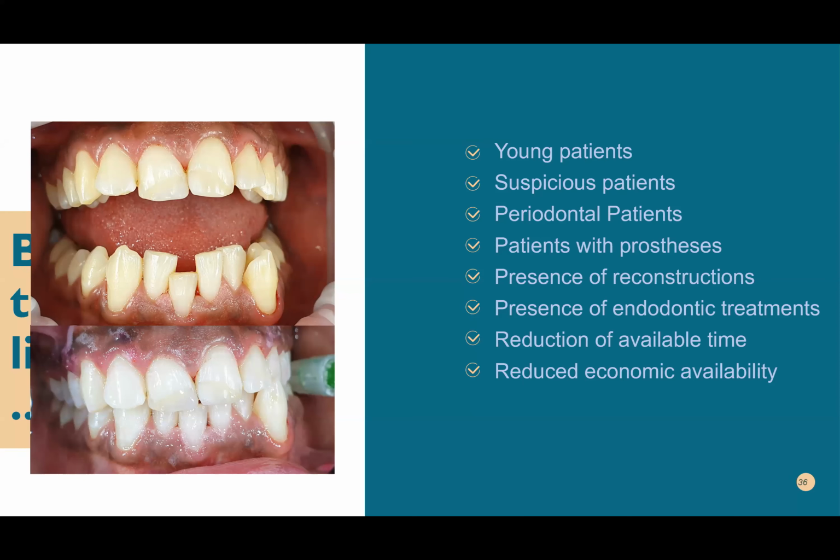This was at the beginning in the top image. Then at the end, after the click, the patient was really happy, and we referred this patient to the dentist to change the composite. Once again, it wasn't me saying, you need to remove this composite. No, it was the patient who wanted to do it. So this is our discussion at the beginning of the appointment with the assessment. And I found an opportunity, saying, okay, we have something that is not really invasive that we can try.